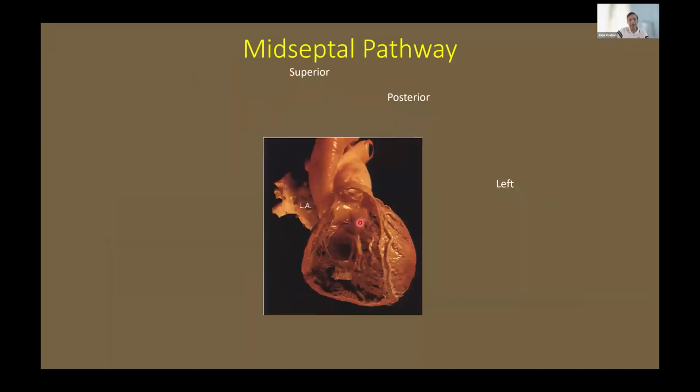Now, moving on from anteroseptal, which is all the way over here and right in the front, to midseptal, which is a little bit behind. Now, obviously, if a pathway is midseptal, there is myocardium in between the pathway location and the chest leads. And hence, unlike an anteroseptal where you would expect negativity in V1 to V3, here you could expect some positivity in V1, V2, V3. So here too, 1 and AVL are far away from it, and myocardium is going to be activated from here. The vast majority of the myocardium being left ventricular is going to get activated and pull the vector in that direction, giving you positive deflections in 1 and AVL.